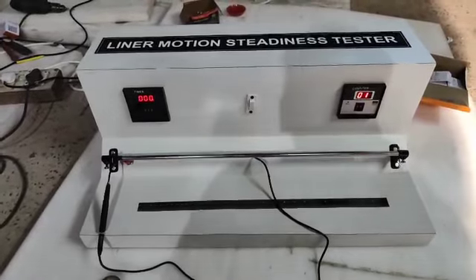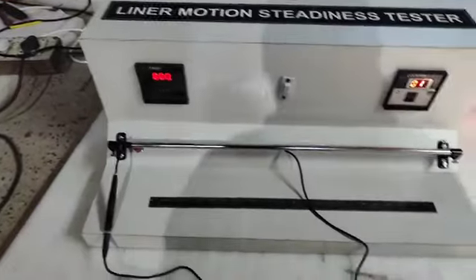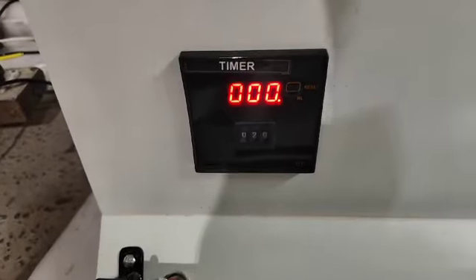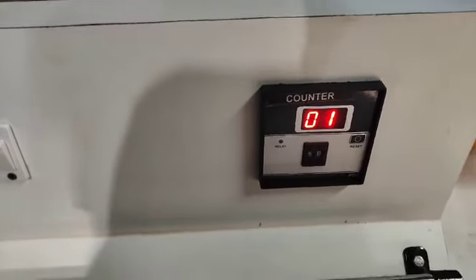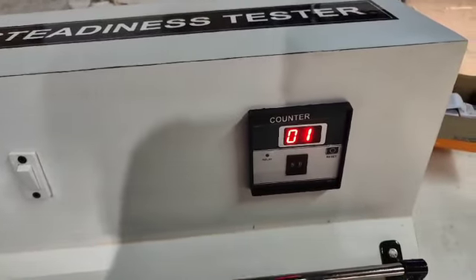Whenever the patient touches the rod, there will be a sound alarm. This is the timer — the total counter timer. You can adjust it, like a 20-minute timer, which I have already set. The counter I have set to 50, but suppose you want a patient to complete 25, you can set it accordingly.